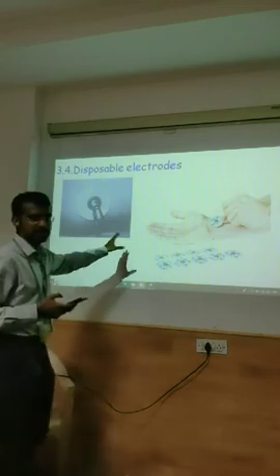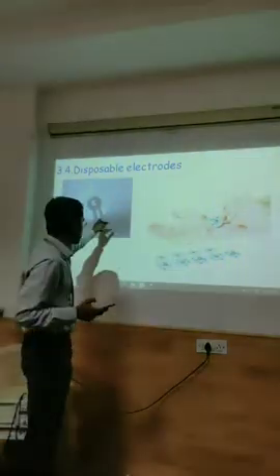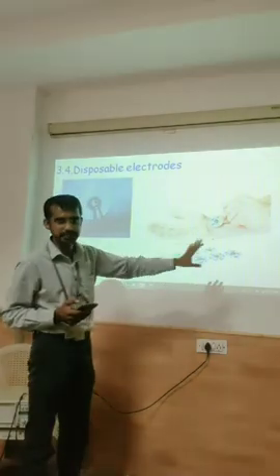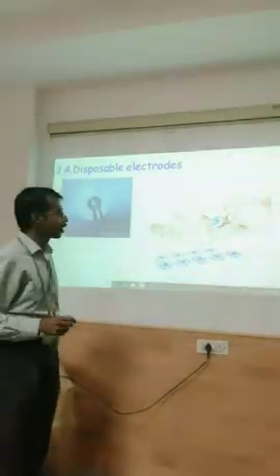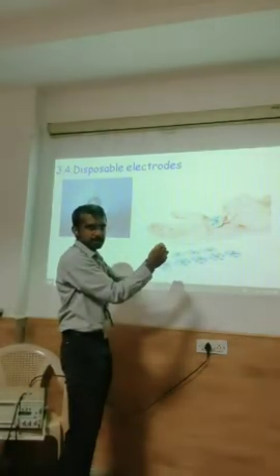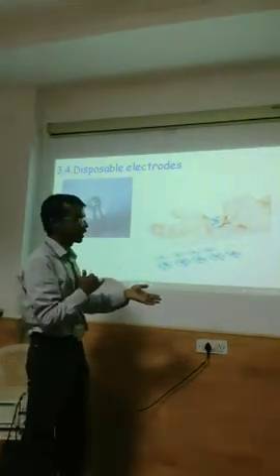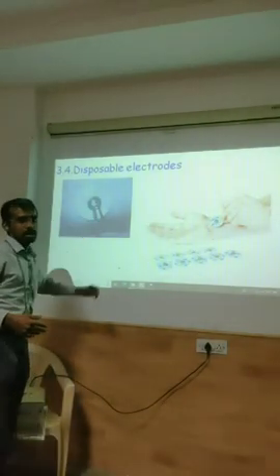So this is also a surface electrode. Most probably you have seen this in all hospitals, right? There will be a white colored patch with a metal surface inside. This is also kept on the surface, so it comes under surface electrodes. But it is one-time use. You have a glue material; you remove the outer cover and there will be ready-made glue. Wherever you want to keep it, you keep it, and from there the signal is picked up.